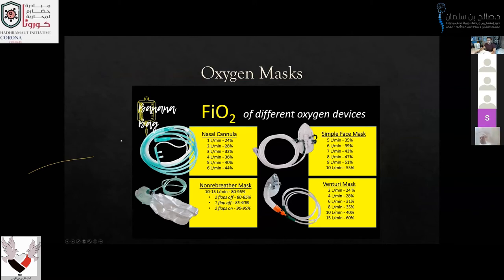I am not really comfortable with this diagram, but it is the only diagram I found measuring the fractionated inspired oxygen through each type of mask. Whoever likes to read it can do so with this.